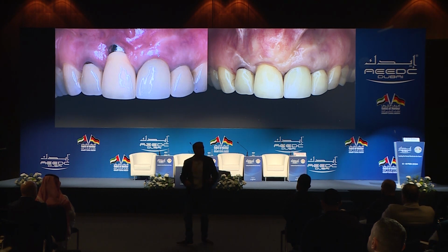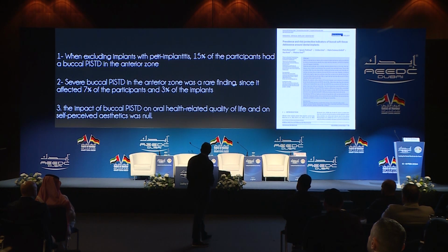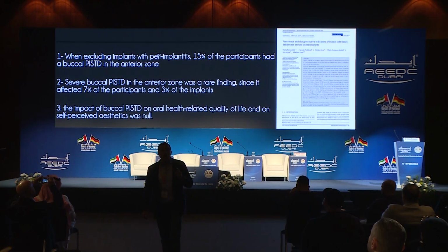In one surgery, we were able to improve the quality of this patient's life, because when she was smiling, she was showing the titanium, and now with just one surgery, she's okay and happy with the smile. And when you look at this recent article on placing the implant too far to the buccal, 15% of our patients today are suffering from this. 15. So almost 2 patients out of 10 have this issue.